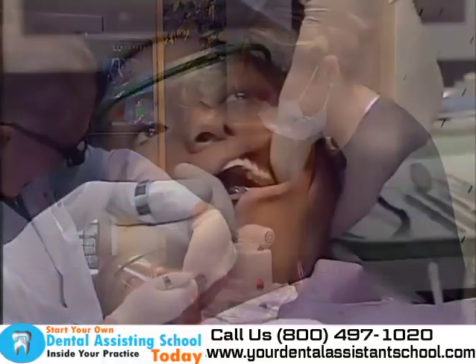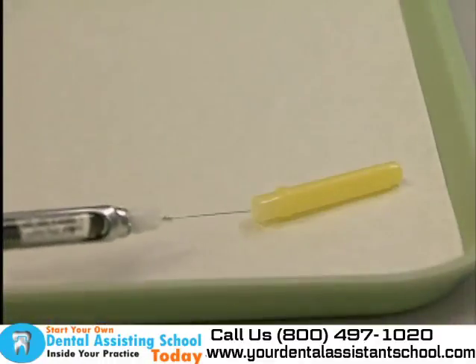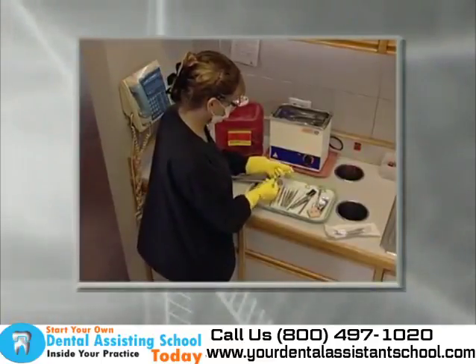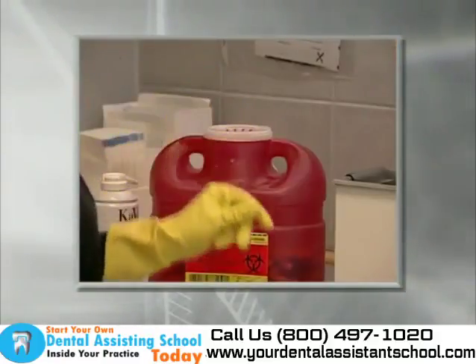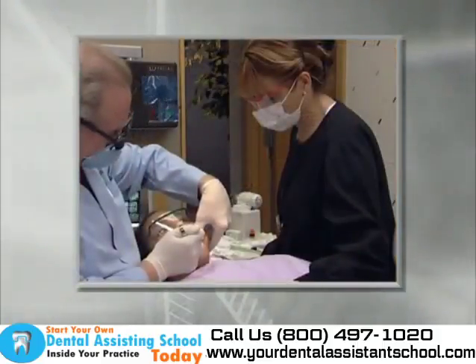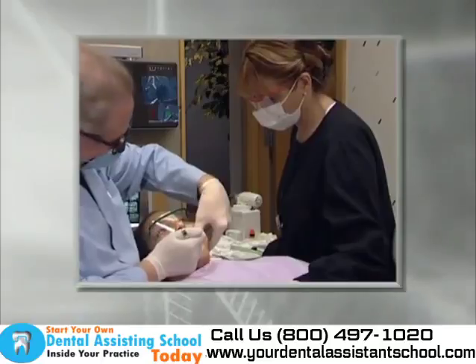Once the needle has been used, there is a risk of contamination for the dental staff. When anesthetic administration is complete, the needle should be recapped using either the one-handed scoop method or by using a specialized device for needle recapping. Once the dental treatment is done, the dental assistant carefully removes the needle from the syringe and disposes of it into a sharps container. The syringe must be properly cleaned and sterilized before using it with the next patient. If there are questions regarding an anesthetic procedure or type of anesthetic or needle to be used, the dental assistant should ask a supervisor or the dentist involved in the procedure.